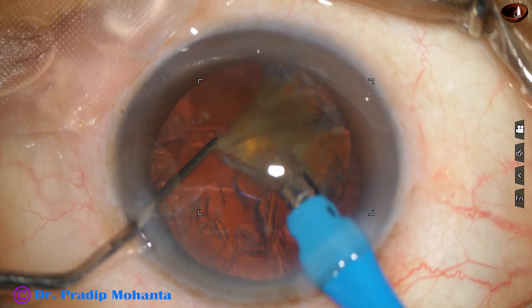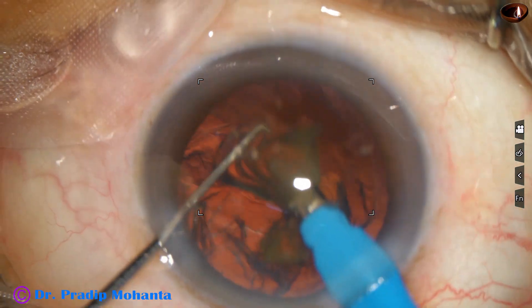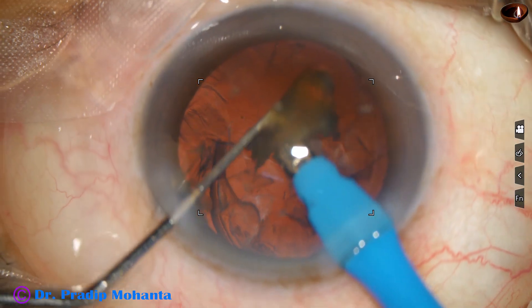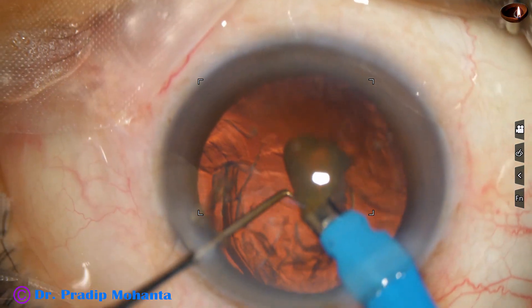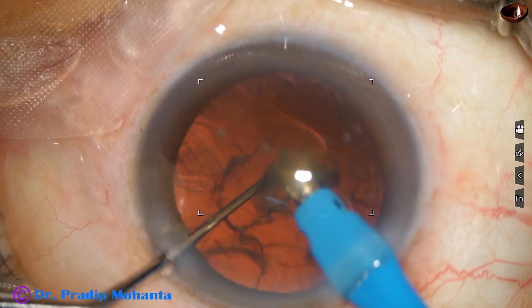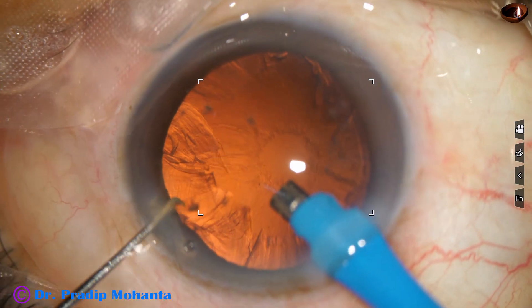This is the last nuclear piece. At this time we have to be very careful — I decrease the parameters. Initially the vacuum was 450; now it is 300. Flow rate was 45; now it is 30. So during emulsification of the last nuclear piece we have to be very careful. We should decrease the parameters and slowly emulsify the last piece.